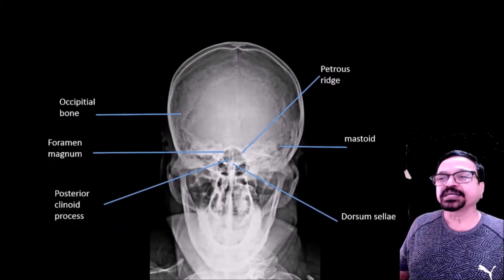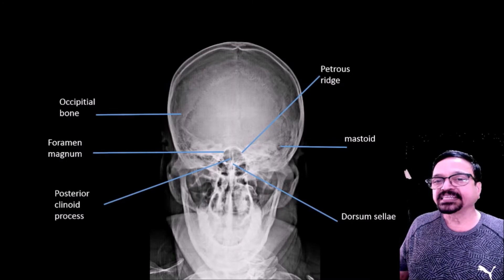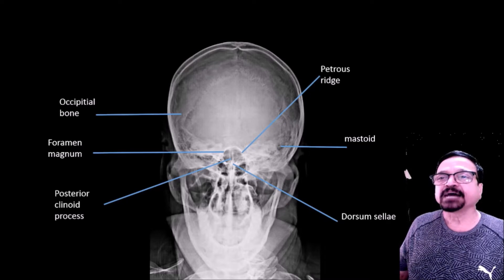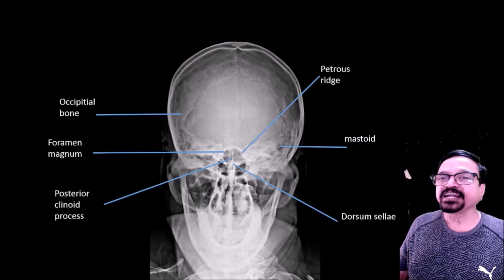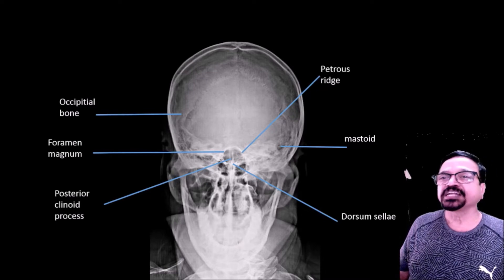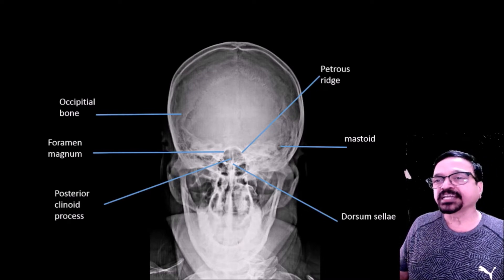In the Towne's view you can see the dorsum sellae and the posterior clinoid processes. The sella turcica is seen in cross-section. Both petrous ridges are projected above the foramen magnum, so you can clearly see the foramen magnum and evaluate any fractures involving it. It is a wonderful view for this purpose.